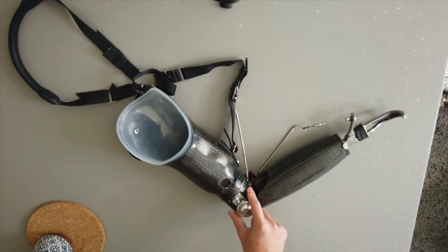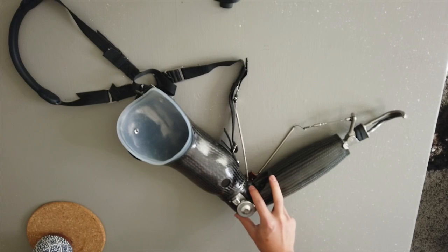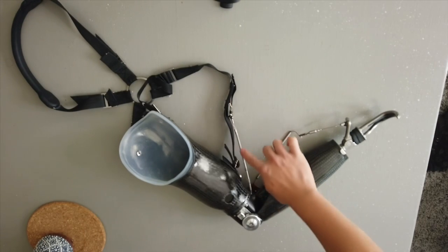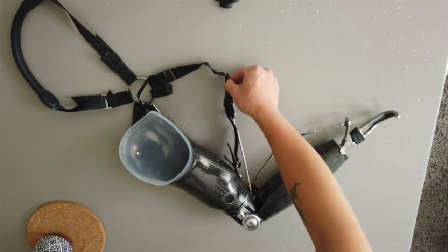Since I am an above elbow amputee, I have a prosthetic elbow. I have another cable right here that's connected to another harness.